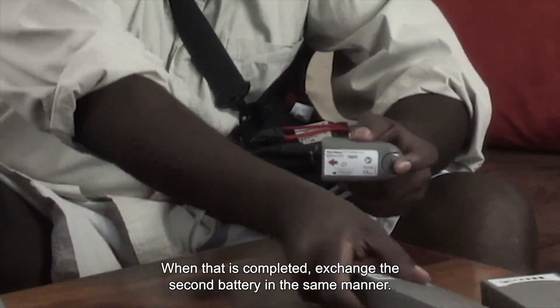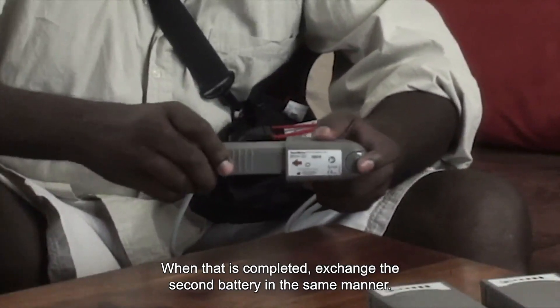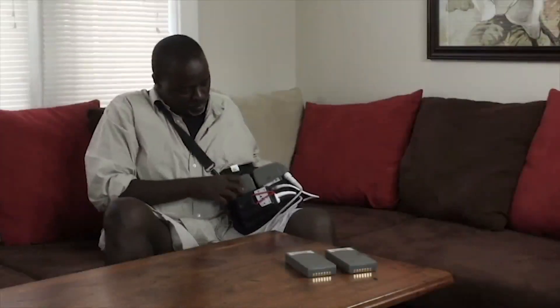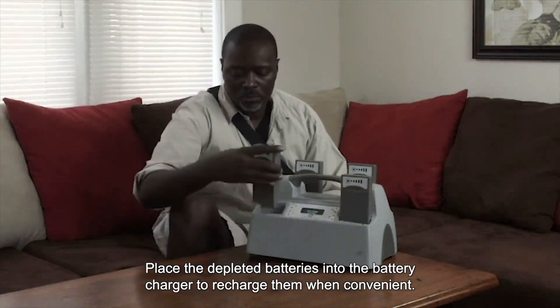When that is completed, exchange the second battery in the same manner. Place the depleted batteries into the battery charger to recharge them when convenient.